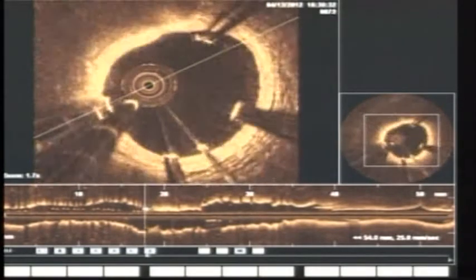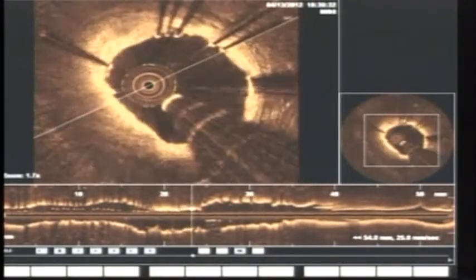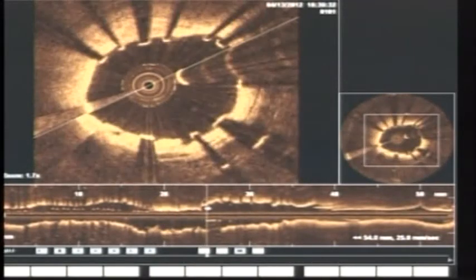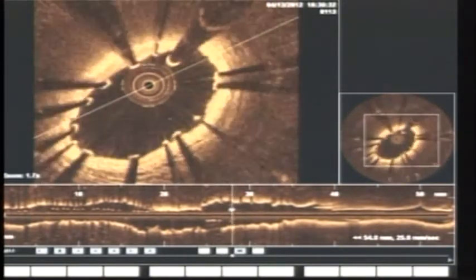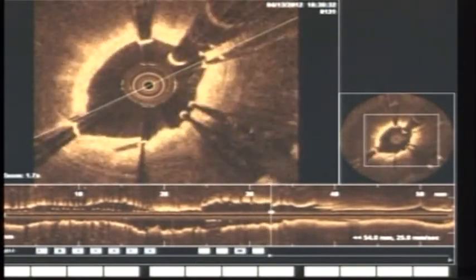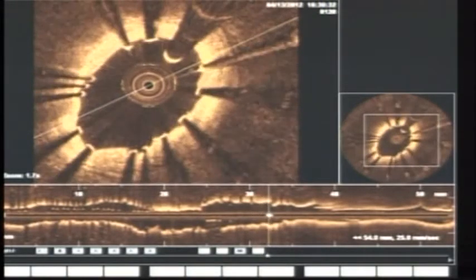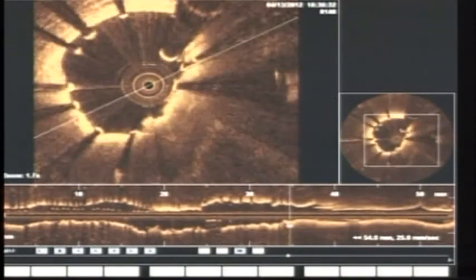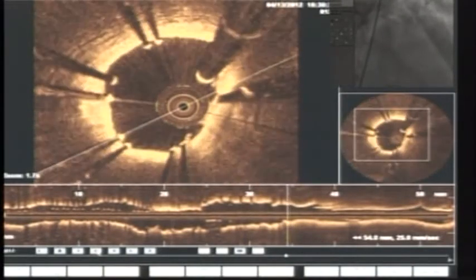Marco, for the LAD, if you want to go ahead, I think we could just treat and then do a final OCT, because otherwise we're going to waste too much time, and Carlos Pedra has to show one case before we finish the session. Right. So you're pre-dilating this LAD, or you're going direct stenting? Yes. If you can show us, because we were planning to do OCT. To me it looks like edge dissection. We needed to change the blood for dye so that we could get good images. Show the angio on our screen, only because we ballooned just the 2.2.